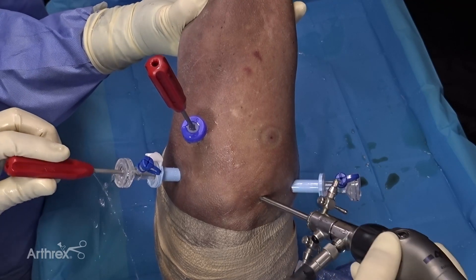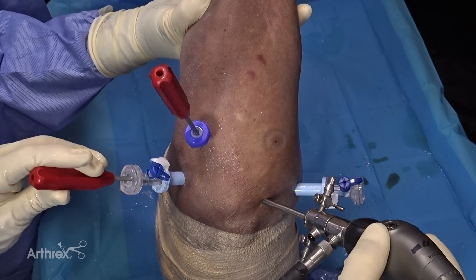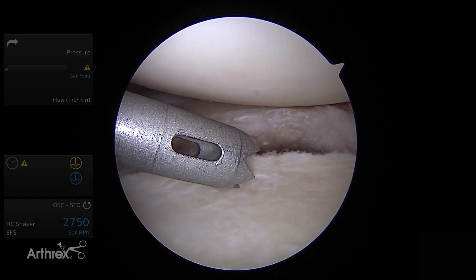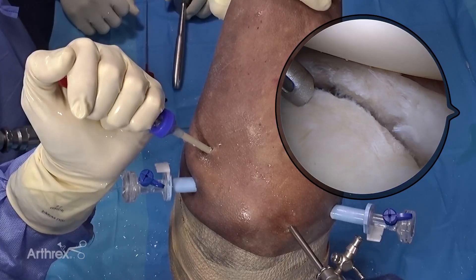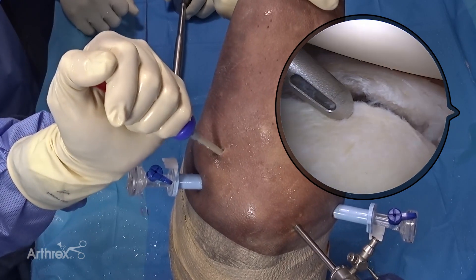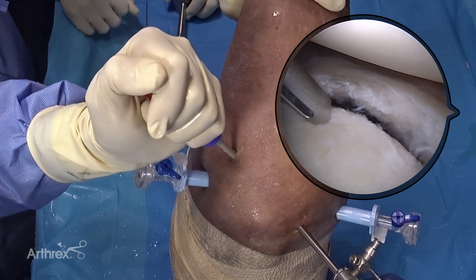Inferior anchor placement is often challenging, and as you can see, the standard posterior portal does not provide the proper angle for drill guide placement. Make sure you have the percutaneous set with the peak cannula for all your instability cases, as it is essential for optimal drill guide position for the 6 o'clock anchor.